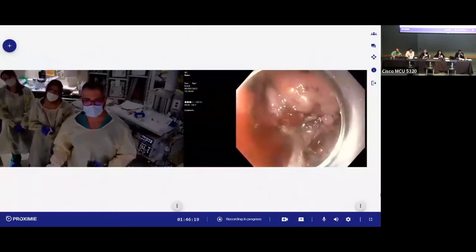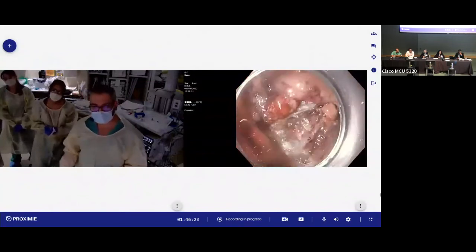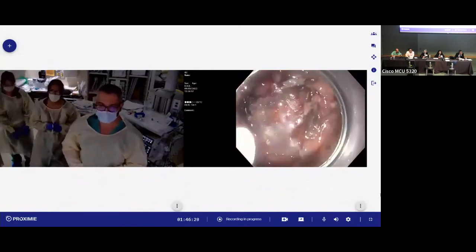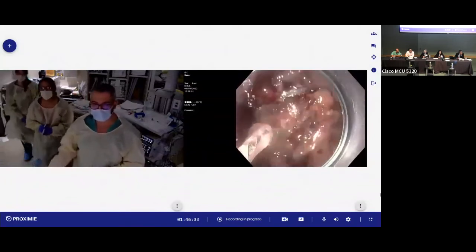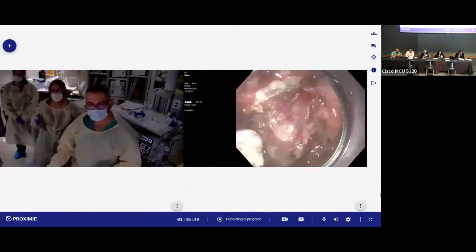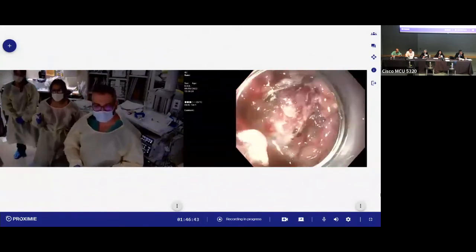Yes, we did ORISE for injection previously, and you can see that there is still some blood vessel that's bleeding here. Let's get the tip of the snare and go to soft coagulation. Yeah, 5 and 50 is okay. Then we'll just go soft coagulation here. I still have some tissue around it, so it's not going to work perfectly.